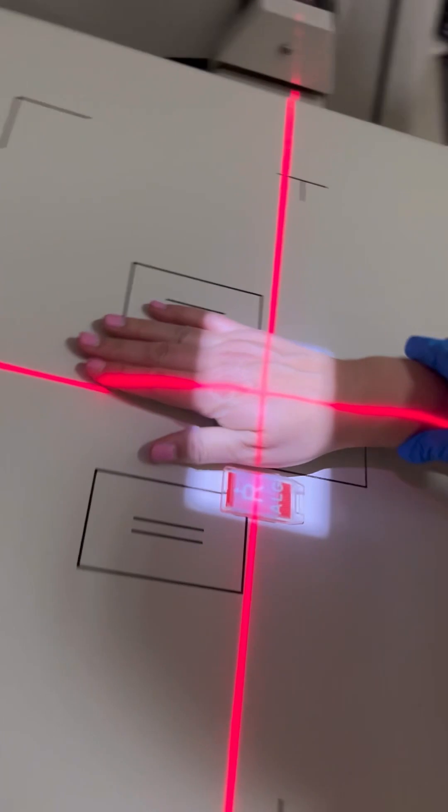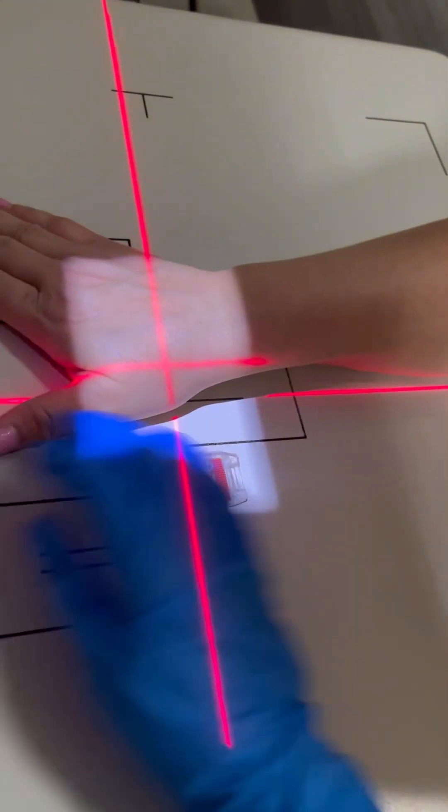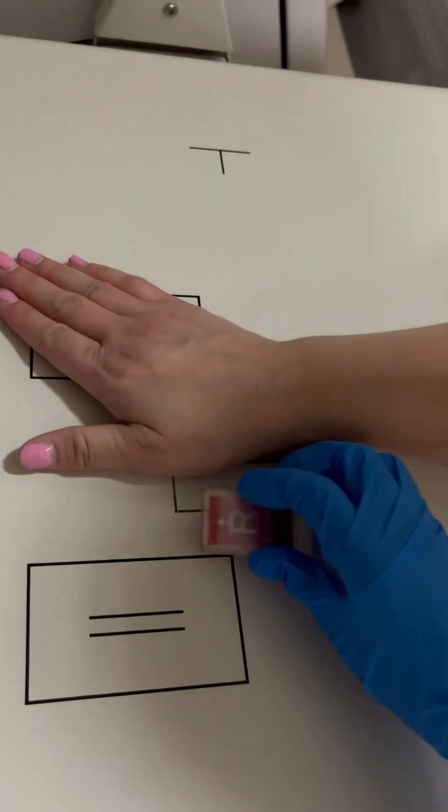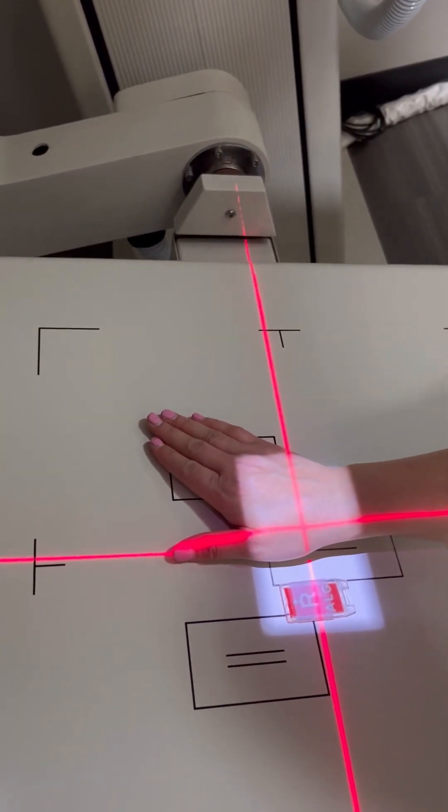We would do the same thing, which would be ulnar deviation, and center in that little snuff box area. That'll give you a nice open view of the scaphoid.